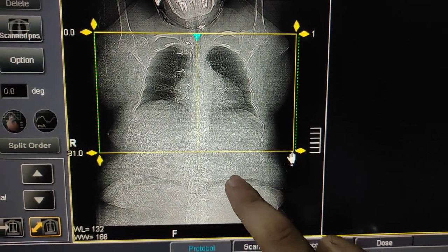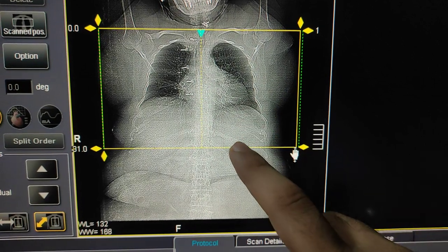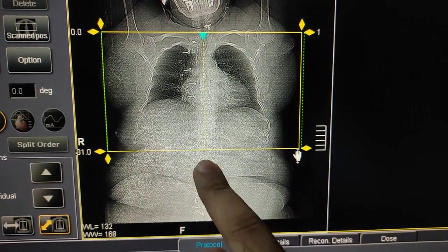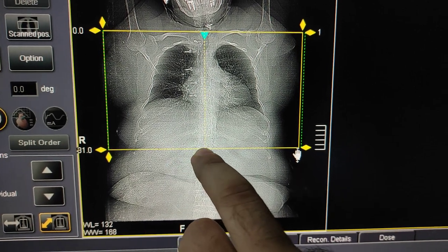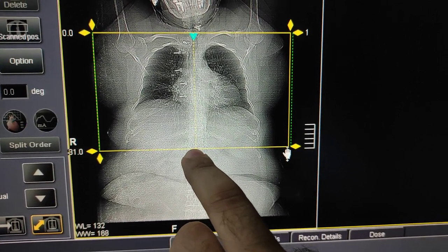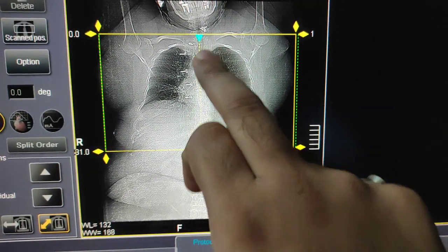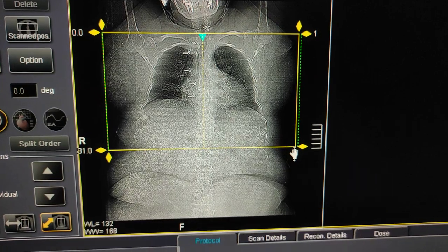If you cover only the black area, you will miss the lower lobe. So you have to cover up till this last rib — this is D12. This is the apex, so the coverage is from apex to D12 vertebra.